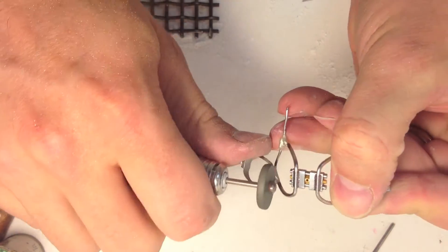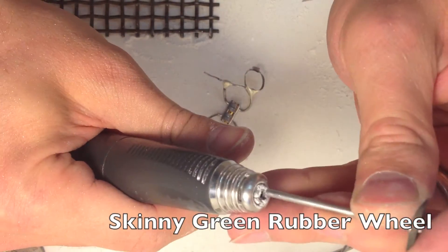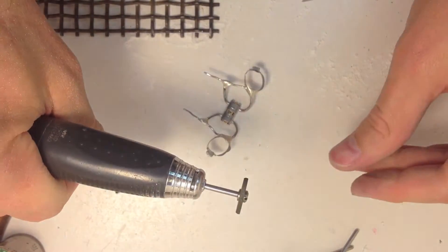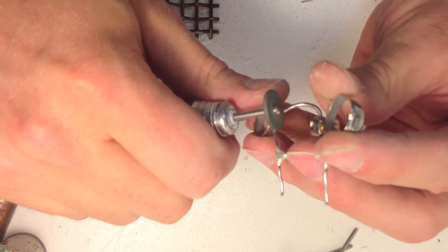You can already see it's starting to shine up. The same rubber wheel, just smaller. Now I can get into the nooks and crannies.